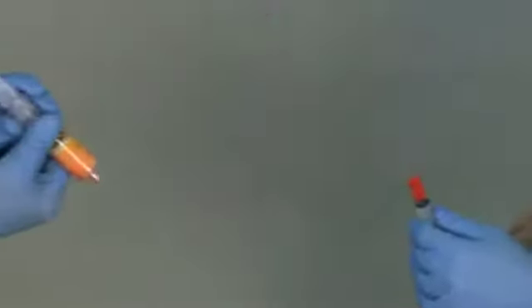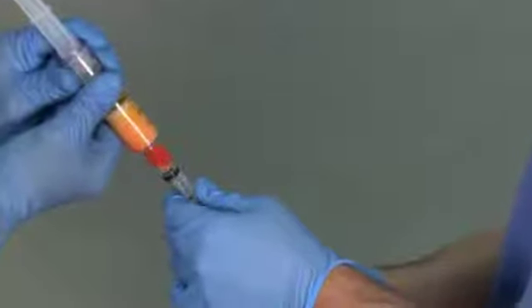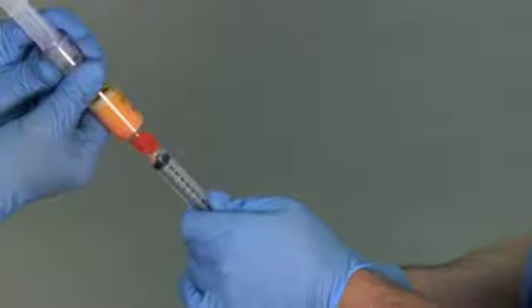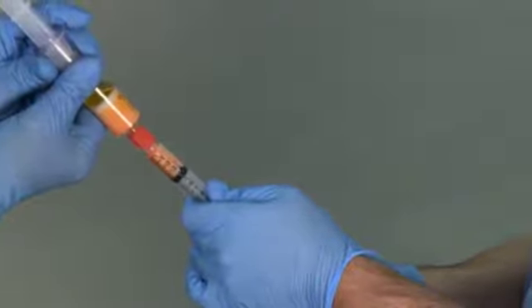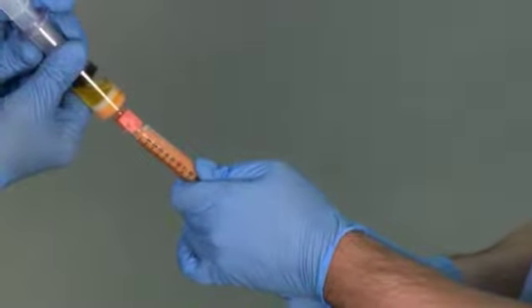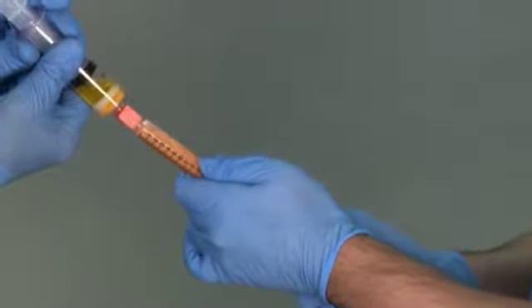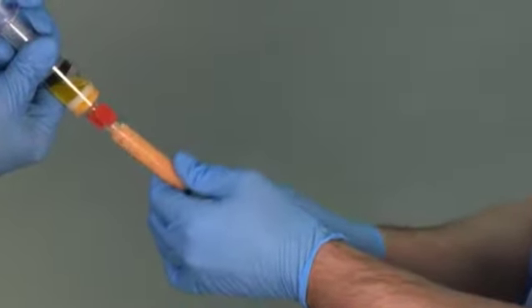Within the sterile field, attach a female-to-female connector to a sterile treatment syringe. While maintaining the treatment syringe's position in the sterile field, attach the AdiPrep process disposable via the female-to-female connector. From the sterile field, draw the concentrated adipose tissue into the treatment syringe. Remove the treatment syringe from the female-to-female connector, leaving it behind with the processing disposable outside the sterile field. The concentrated adipose tissue is now ready for clinical use.